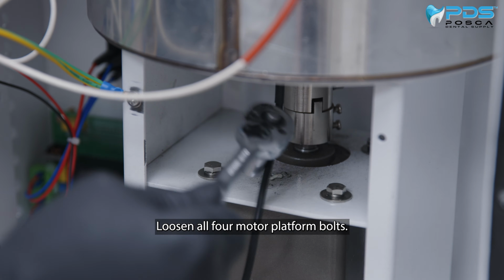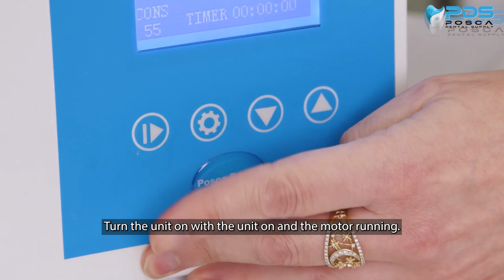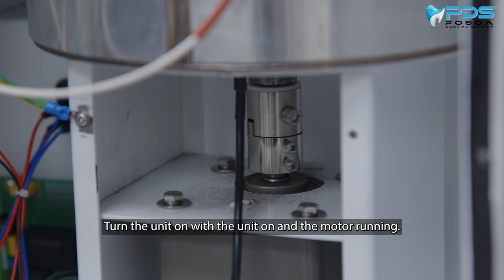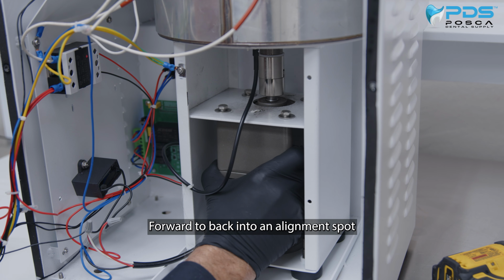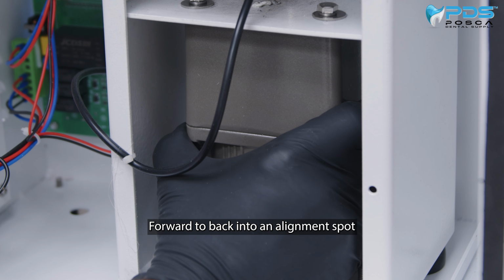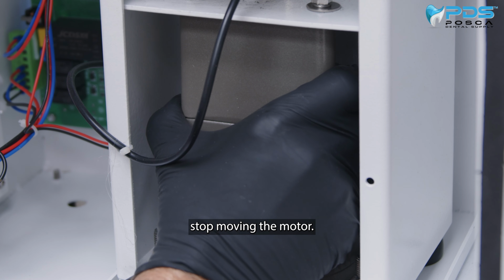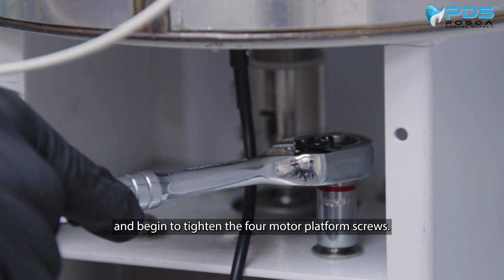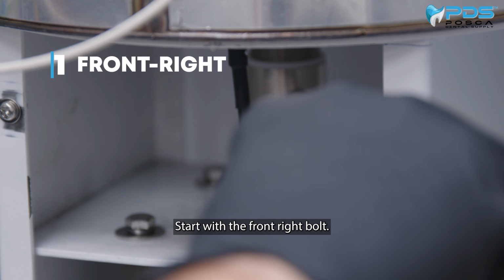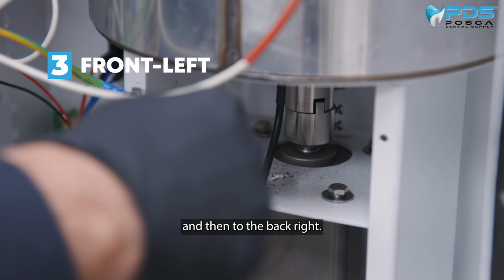Loosen all 4 motor platform bolts. Turn the unit on. With the unit on and the motor running, gently grab the motor and move it from side to side, forward to back, into an alignment spot where the noise stops. Once you hear the noise stop, moving the motor, hold in place, and begin to tighten the 4 motor platform screws. Start with the front right bolt, move to the back left, to the front left, and then to the back right.